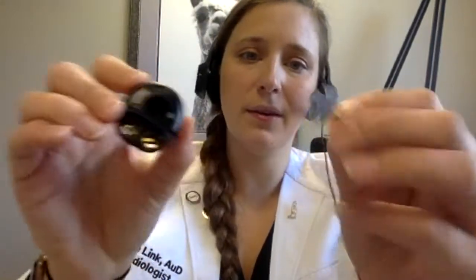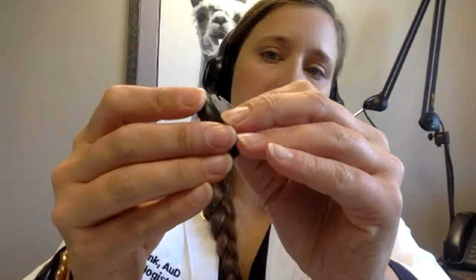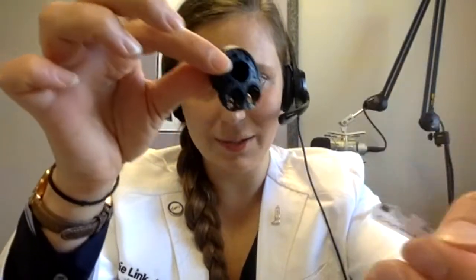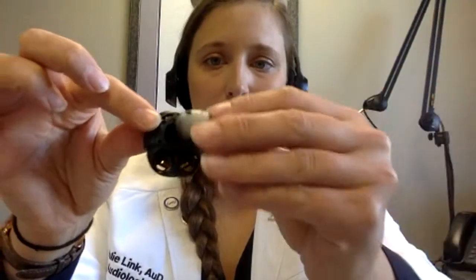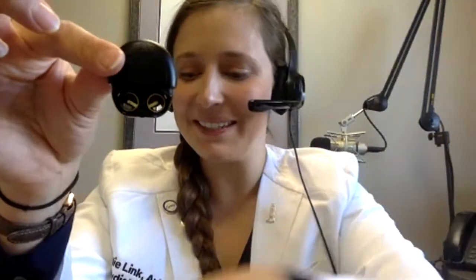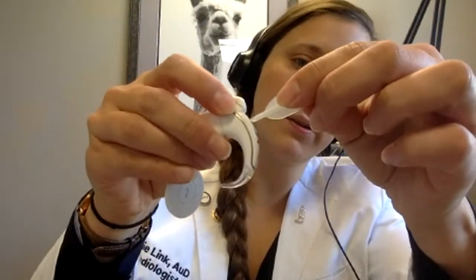So once you have both of these out, you're going to line these up like this. Give her a little push. That'll get that set, and then peel this off, and you've got your new filters in there. To put it back together, you have your button up here. You want to line your button up here. And it'll just pop right back into place, nice and easy. And then we want to put our battery cover here. Same thing with the behind-the-ear implant. So we're going to grab it in here, right? Pull that out. This one here.